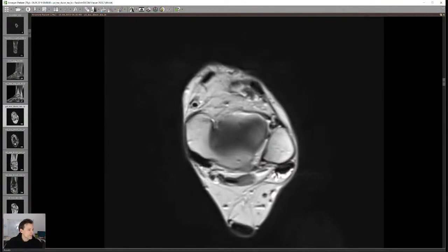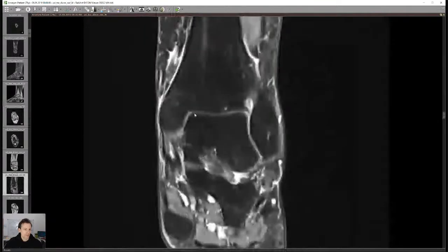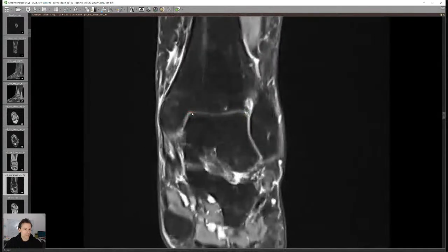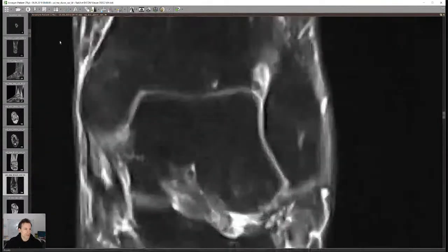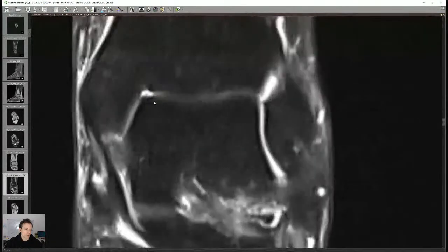Pablo from Peru is asking: how do you localize osteochondral lesions in the talar dome? Do you use any particular classification, and do you prefer to measure diameter or area? The best view for OC lesions is on coronals, as they're typically at the same location — medial talar shoulder or that region. I describe them as small, moderate, or severe, then describe subchondral cysts and bone marrow edema. If there's obvious cartilage damage I give the diameter in one plane.